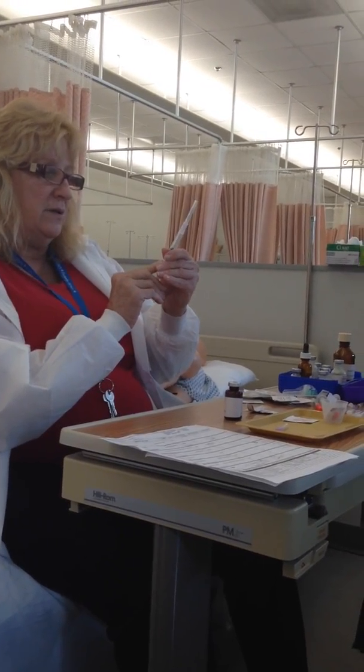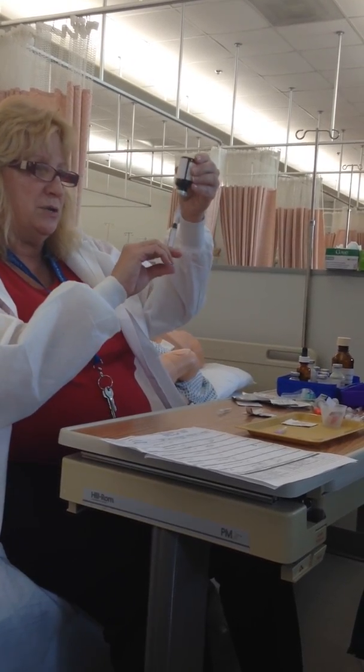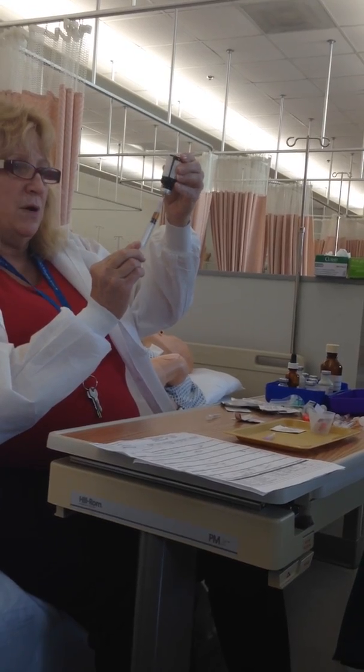And with Clafuran, since it's Z-Track, I'm going to get my 2 milliliters of air. I'm going to go into the vial, and this is the part that I watch you. You're not supposed to touch all up in here. And I watch you draw the medication.